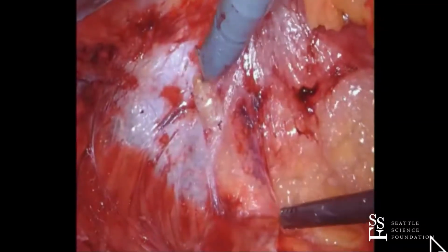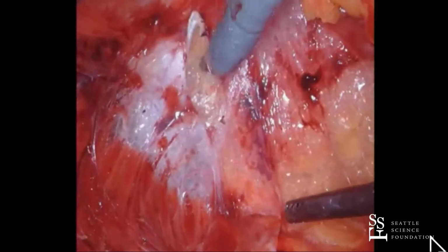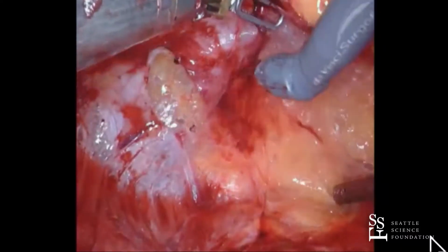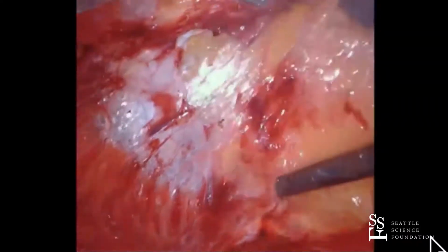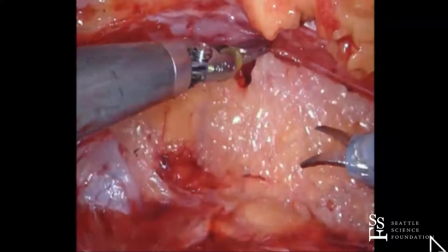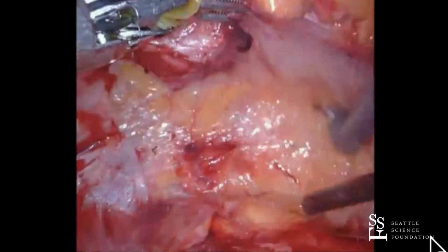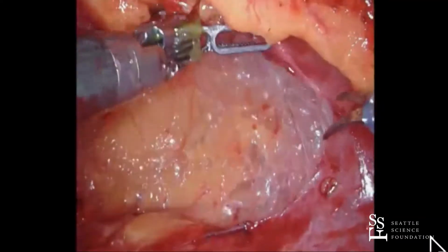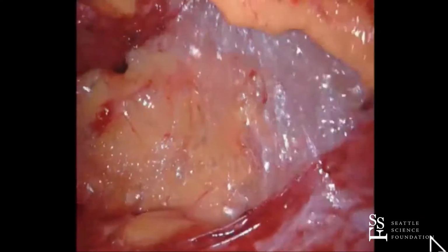You can go that way, but I find if you curve it up, it gets out of your face, this cut edge here. This cut edge here is a very important landmark, especially if you've never done this operation, because if you stay inside this cut edge right here of Gerota's, the upper edge, that's going to keep you within the kidney. If you get outside of it and you're not sure where it is, that's when you get in the peritoneum. You'd like to avoid getting in the peritoneum.